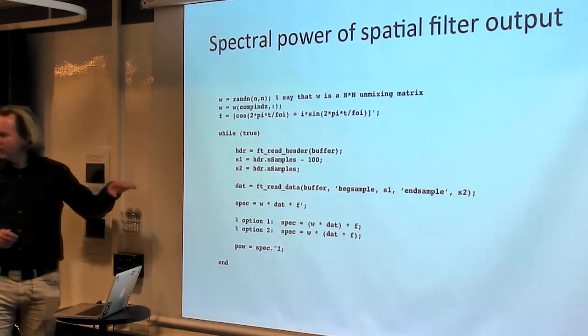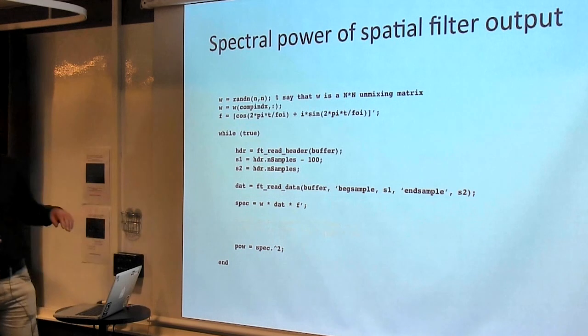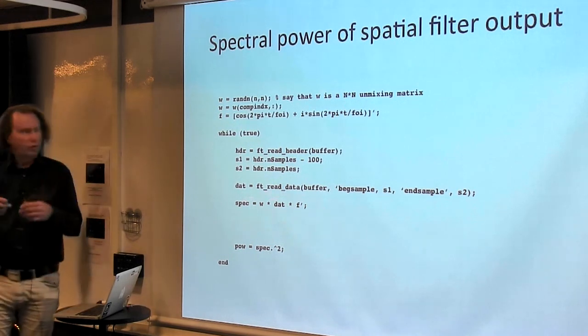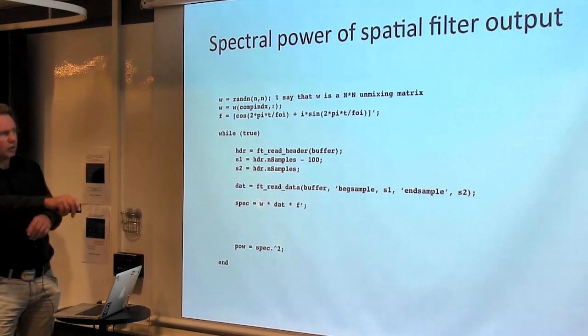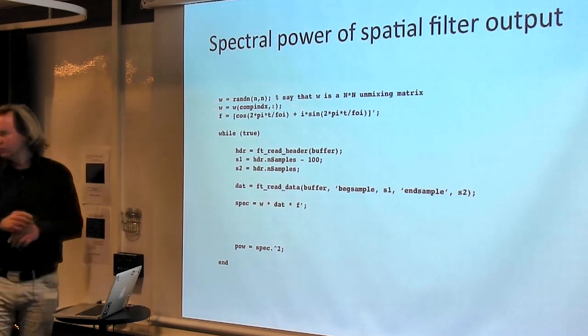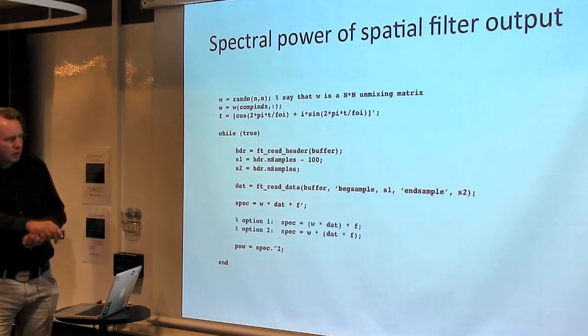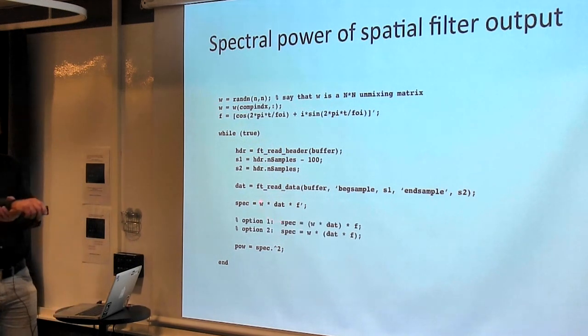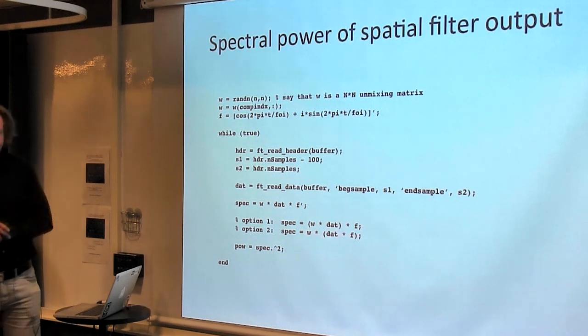And then there's some low-level aspects that you have to consider. So this is one way that I can do the computation. I make the selection of W actually outside of the for loop. But then there's two options. Either I'm multiplying 3 matrices, so either I first multiply these 2 matrices and then that one, or I first multiply these 2 matrices and then that one.